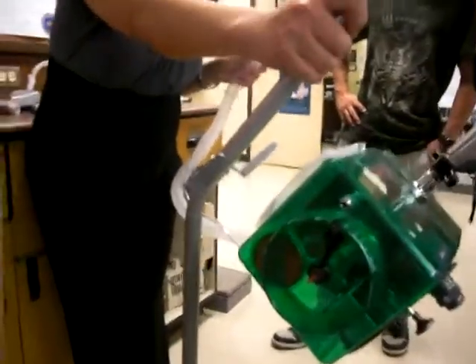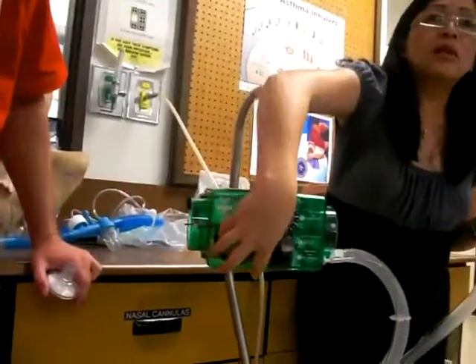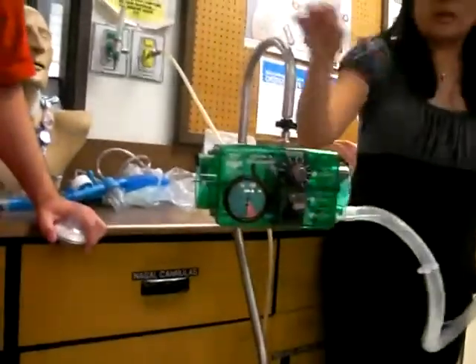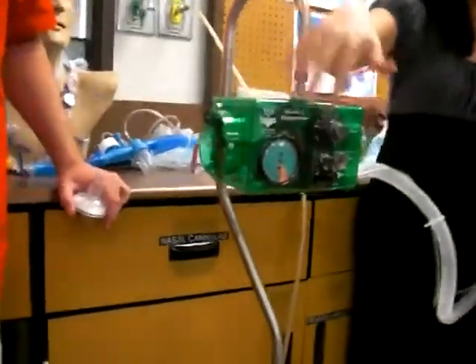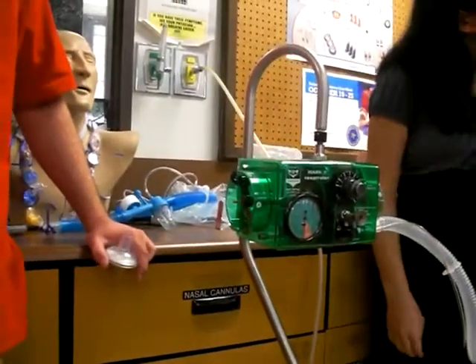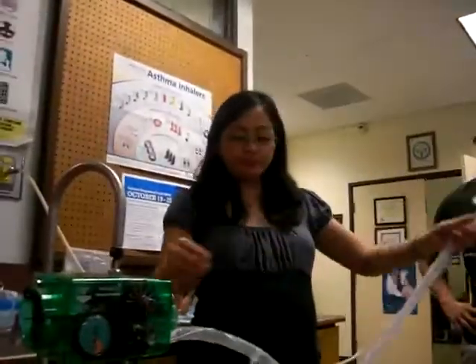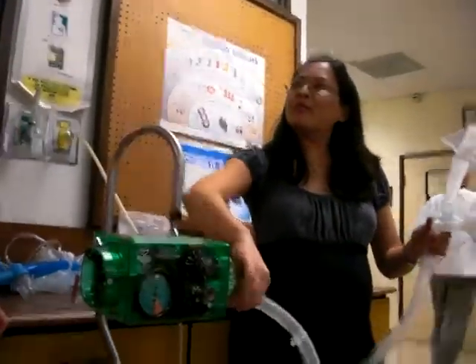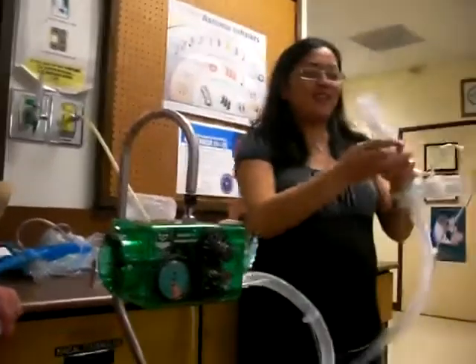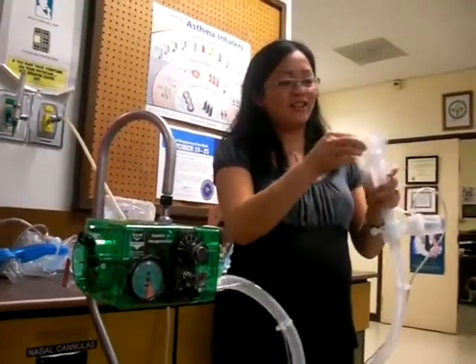If you look at the numbers, 5 to 40 — the higher the number, you're going to make it really hard for the patient to suck in. So start at around negative 1 to negative 2. You don't know if that's negative 1 or negative 2 — what are you going to look at? You're going to look at your manometer. So I set my flow, I set my pressure, and I set my sensitivity. Now I ask Bo — I'm going to use a mouthpiece with him.